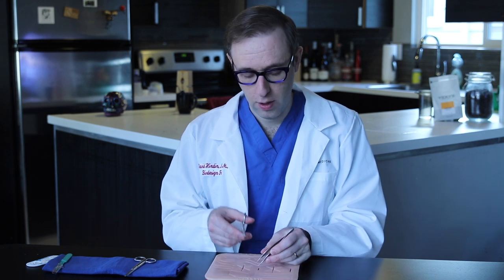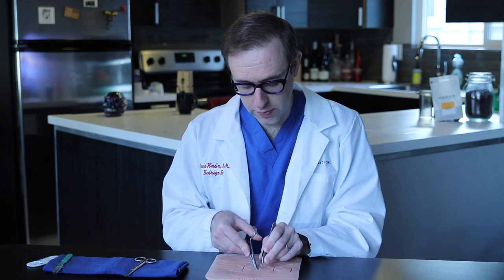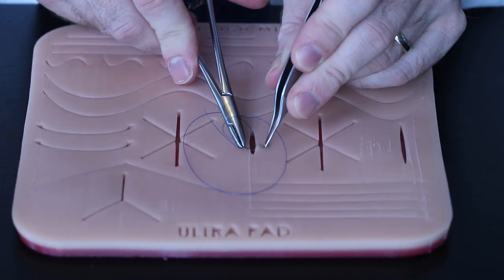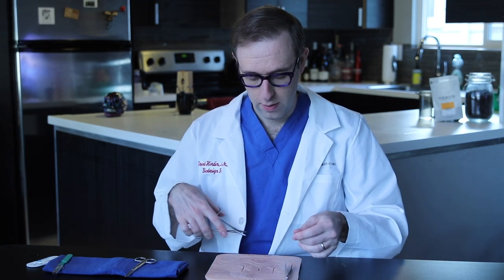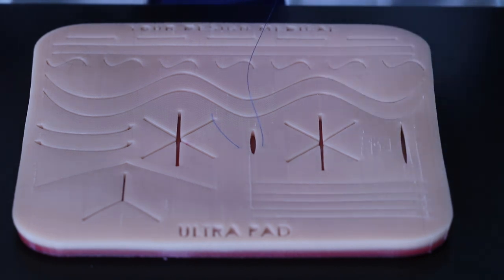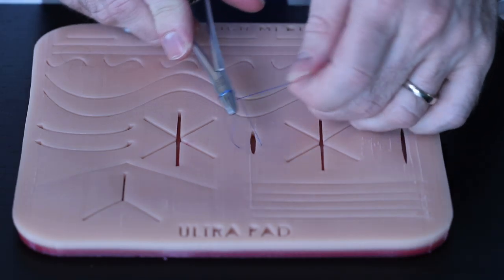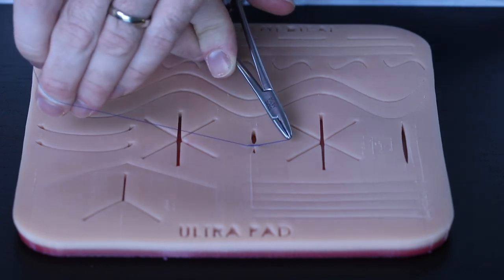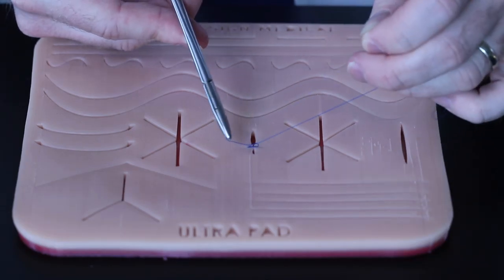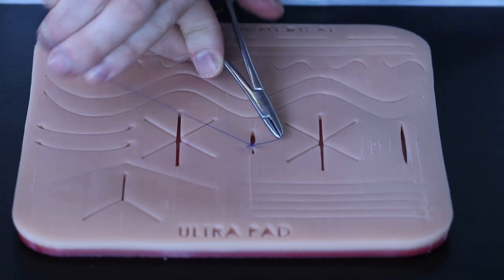As we'll see when we suture, what we do is we grab the skin edge, pass the needle through, bring it up to the middle, and then cross over to the other side. Depending on the suture and the incision, you might be able to take it all in what we call one bite without having to come up to the middle. When you bring it through, you're going to leave a little bit of a tail that we're going to instrument tie to. I'll show you how to do hand ties in other videos, but for this one we're just going to use our needle driver. We're going to carry two loops on the needle driver, then cross our hands so that the knot comes down square, or what we call flat. Then we'll let go, pull it in the other direction, and keep alternating.